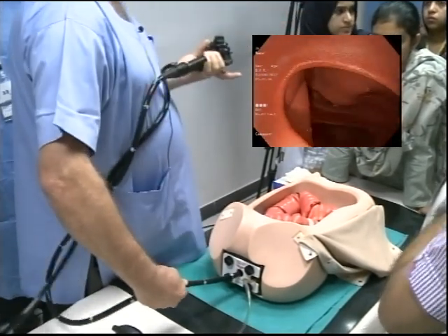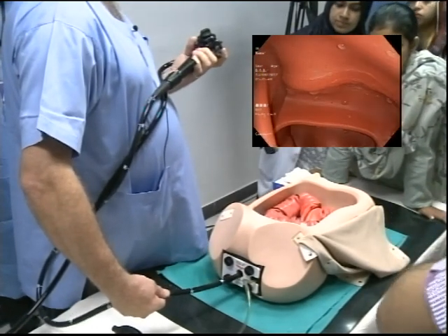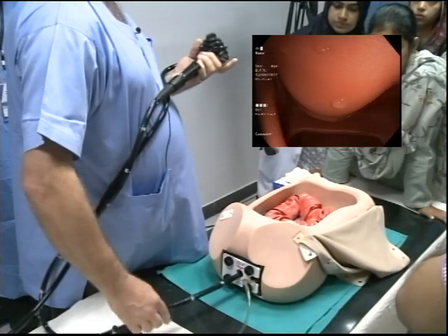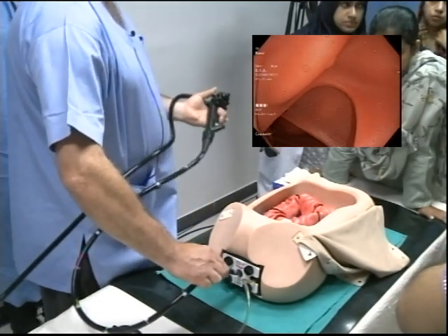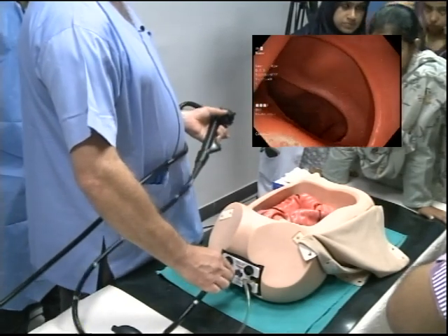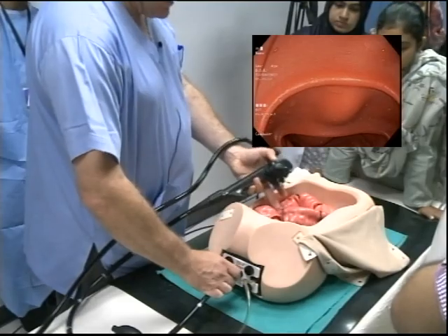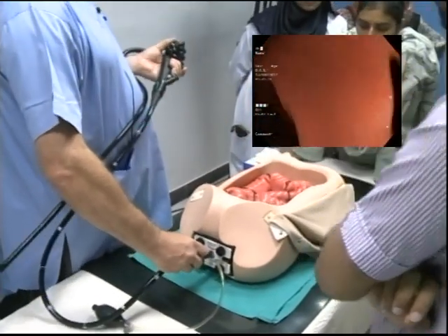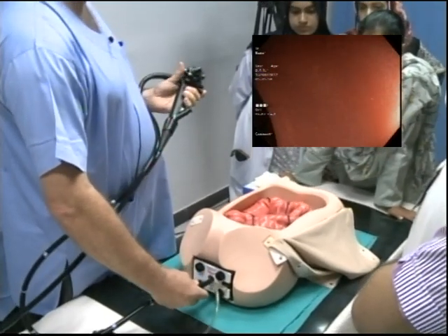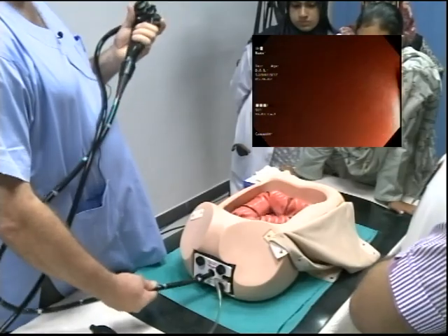I'm looking at that one. Point at 12 o'clock. You see how much you're sucking down? Right? And then advance, and then let the scope come round. This is a mannequin, so it is catching and sticking. Can you see here? Now you're pulling here, the mesentery. You don't want to do that. A little bit of torque pulls it round. Let it come round. Let it come round. Let the torque come in.